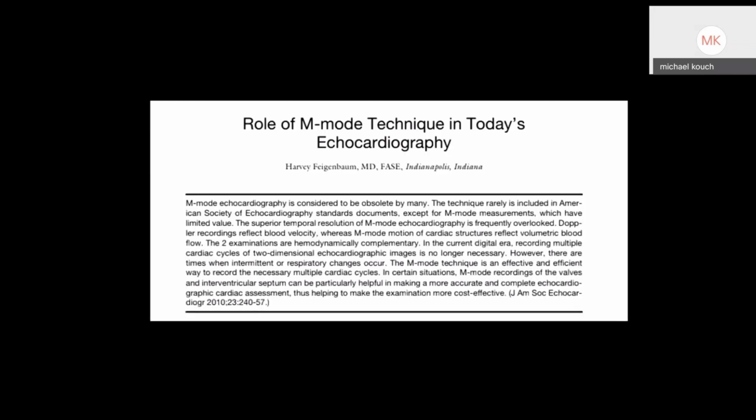So this is the main paper that everyone comments on regarding M mode. It's Feigenbaum's paper, from 2010. It has a lot of the high yield pictures that you're going to need to know for your board exam, and we're going to hit a lot of the main topics today.